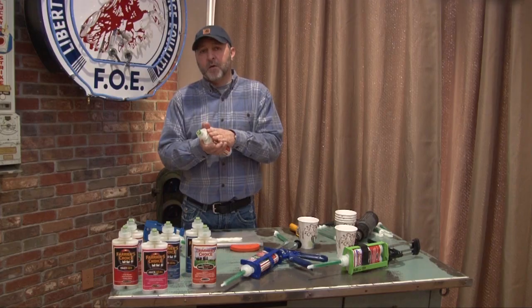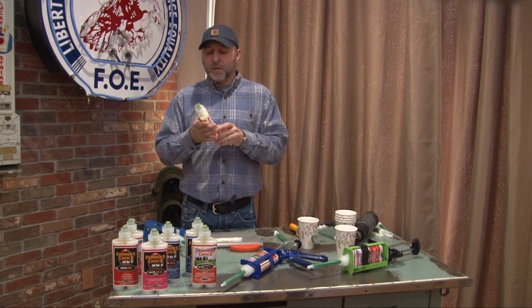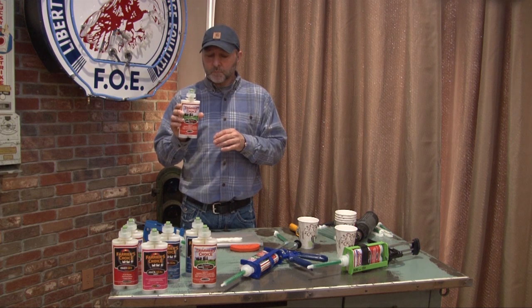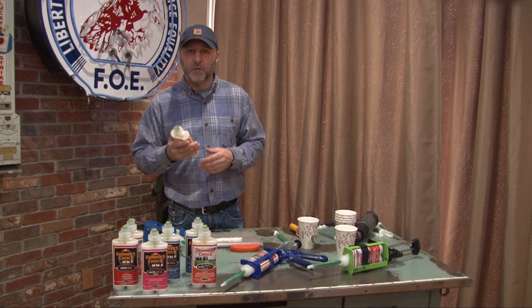So you might be setting that cow down early and it's not quite adhered. There's not enough strength in the adhesion to keep the block there, and it may shift, it may move, it may get to a point where it can be peeled back off. So it's critical to keep the product warm prior to using it on the claw, or the hoof if it's the equine industry.